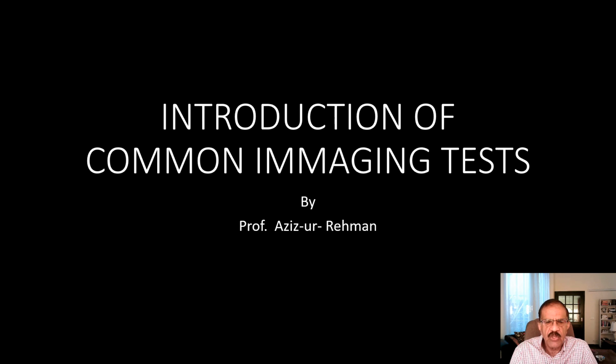Of course, detailed discussion will be beyond the scope of internal medicine, and I will just be giving you a very brief outline of various tests, and then we will take up the radiology part, the X-ray part, because that is the commonest test we do, and that is the one which is usually shown to you in the examination also. Out of X-rays, we will be primarily focusing on X-ray chest in this series of lectures, and today we will cover the normal X-ray chest. So let's have a very brief introduction of various tests available to us.